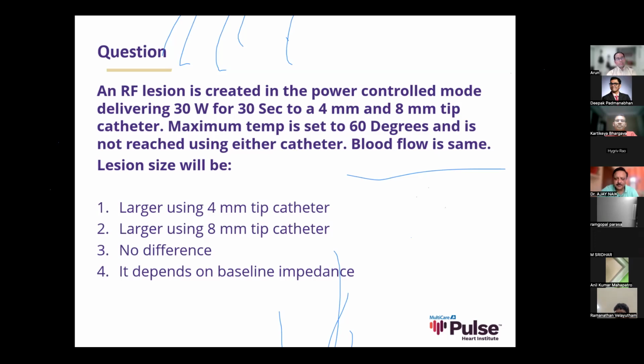Unfortunately, I don't do a lot of pediatric ablations, but I have thinner patients where the impedance can be very, very low. In pediatric patients the impedance is probably even lower. I don't know what ranges of impedance you're dealing with. Our standard in our hospital is 2 grounding patches, and typically when the impedance is low, we take out one of the grounding patches, and that increases the impedance.